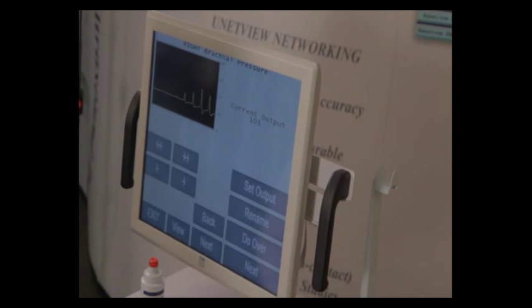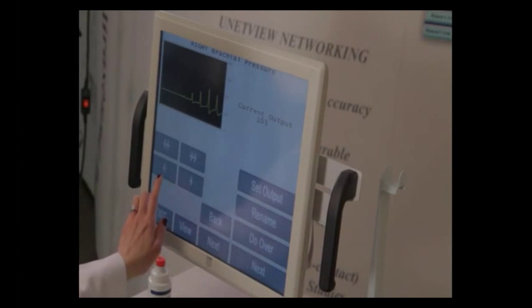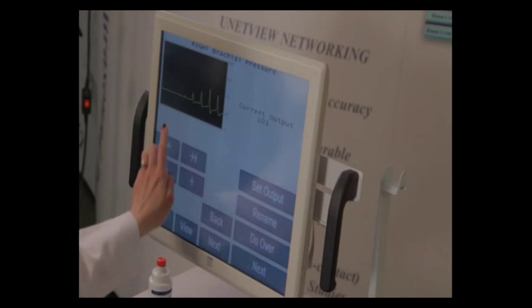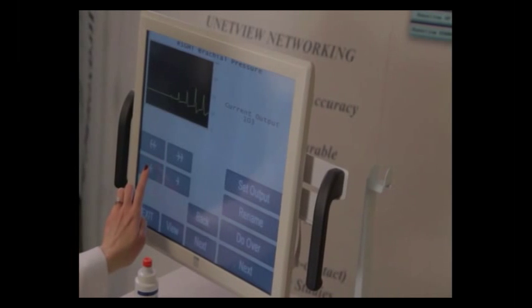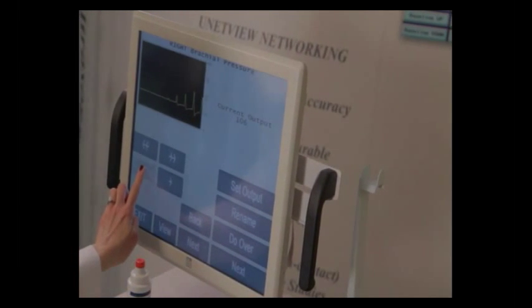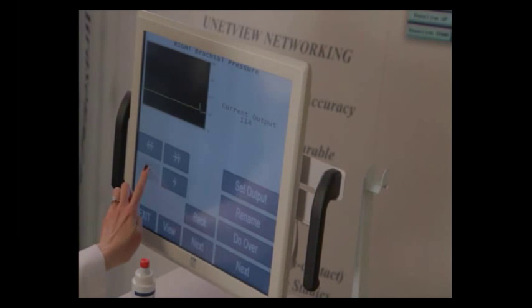Once you press the capture button, you'll bring up the scrolling screen, and what we want to do is we see 1, 2, 3, 4, 5 waveforms on screen. We want to use our slow left scroll button and hold that down until the first waveform, which is the smallest one on the left, bisects the right line on the waveform box.